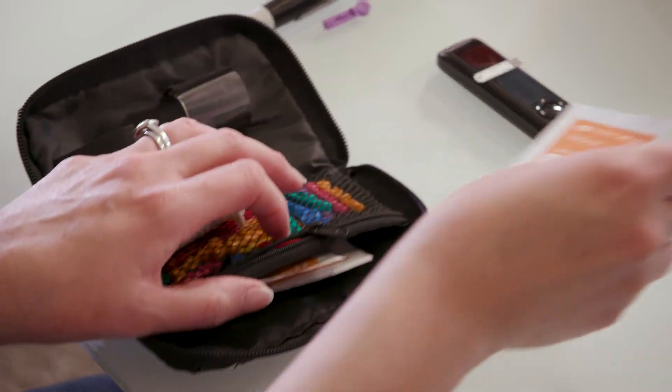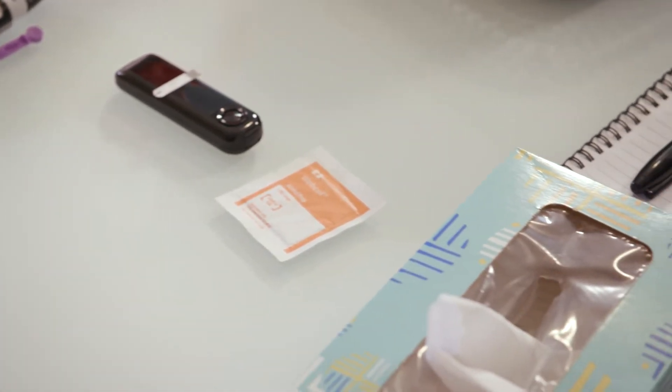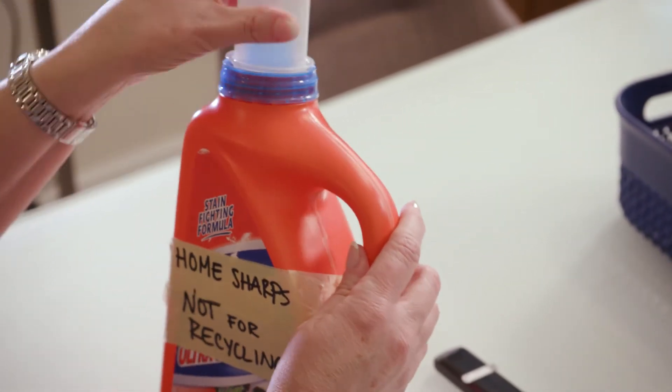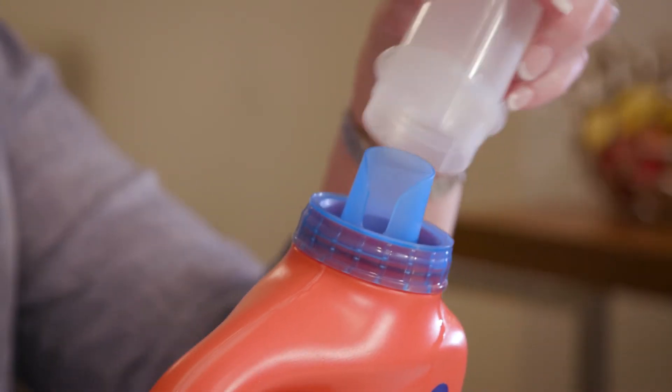You'll use the alcohol pad and clean tissue to clean and dry your finger before pricking it. Finally, you'll need a trash can and home sharps container, such as a hard plastic laundry detergent bottle with a screw top lid.